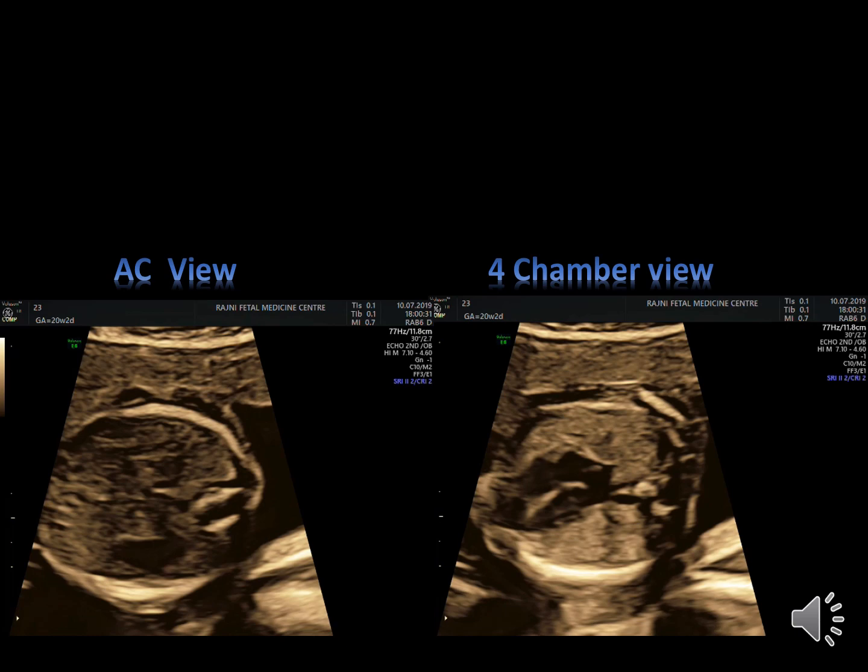You have to follow the guidelines for fetal echocardiography. Your echocardiography should start with the abdominal circumference. Here there is the spine, stomach and portal vein in a clockwise rotation, and the patient was having a cephalic presentation, so that indicates that the stomach is lying on the left side. When you move to the 4-chamber view, you will identify the heart also deviated to the same side, which confirms situs solitus.